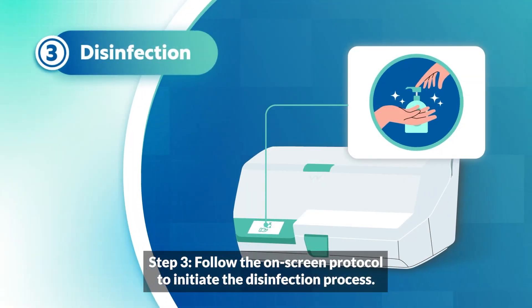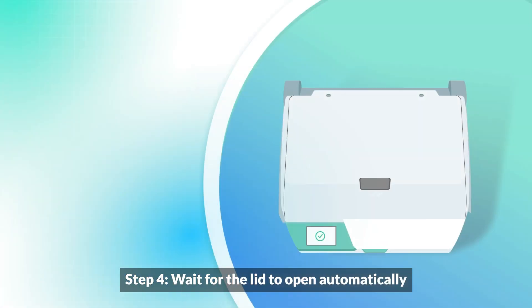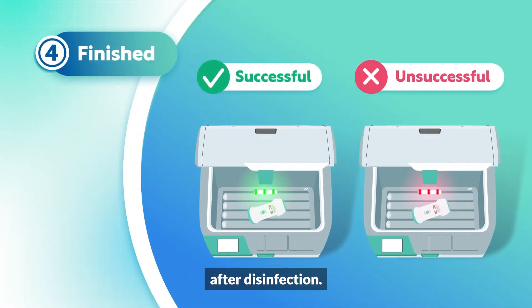Step 3: Follow the on-screen protocol to initiate the disinfection process. The equipment is disinfected and ready for reuse in just 25 seconds. Step 4: Wait for the lid to open automatically after disinfection.